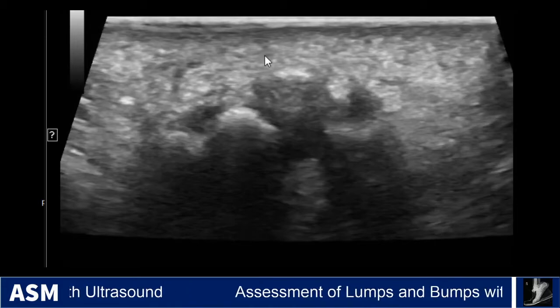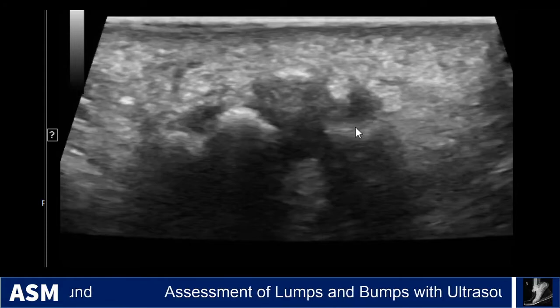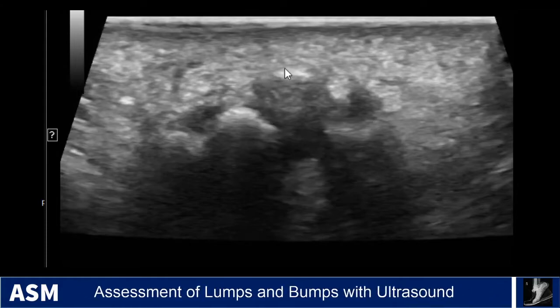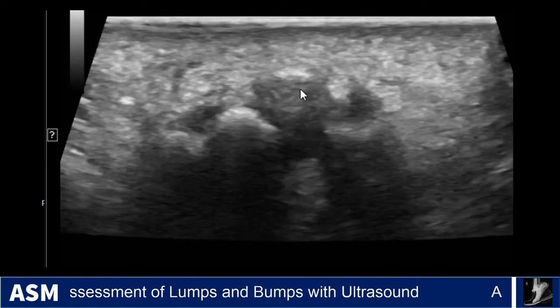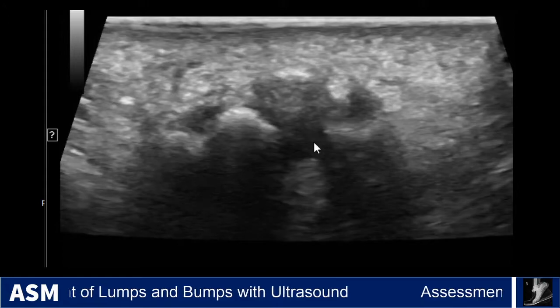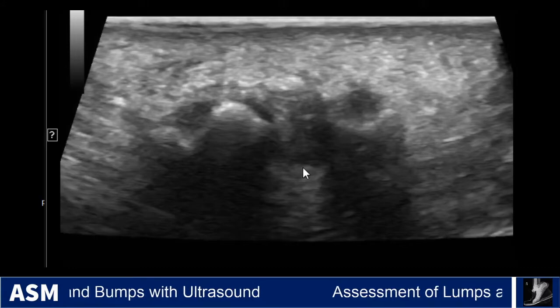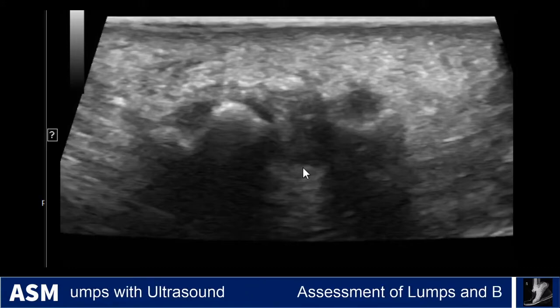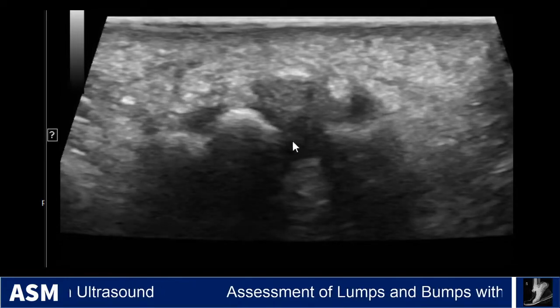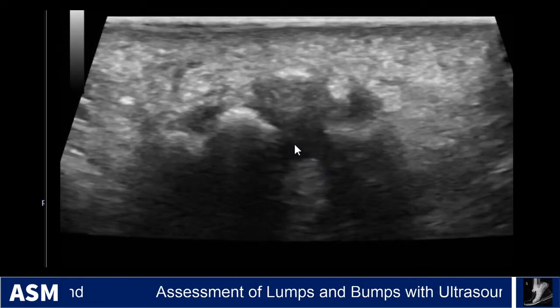We're looking at the plantar aspect of the foot here in cross-section — the second and third metatarsals and the inner metatarsal space. You can see this hypoechoic ball-like structure extending beyond the margin towards the plantar side of the foot. With compression dynamically on the metatarsal heads, this mass will pop back and forth between the metatarsals.